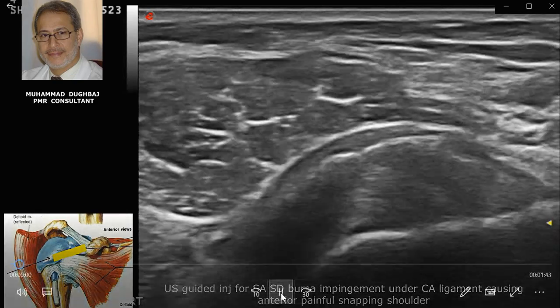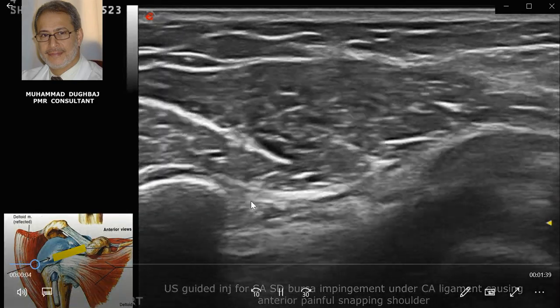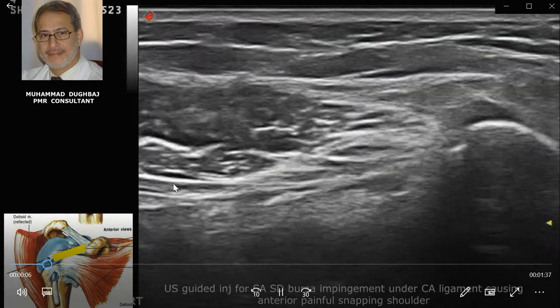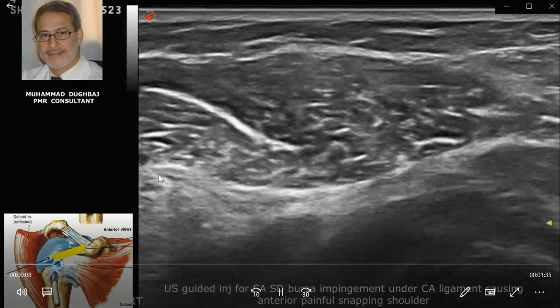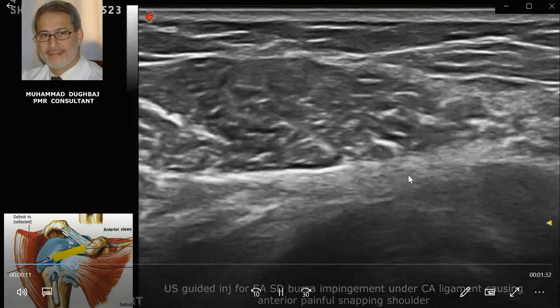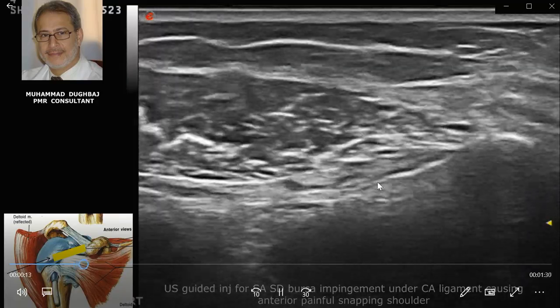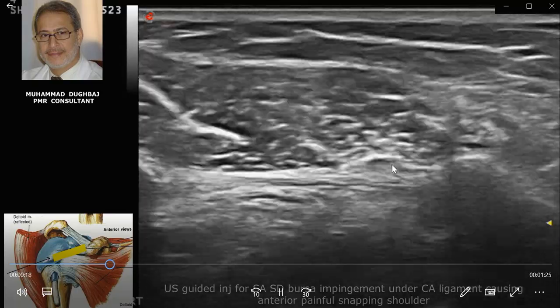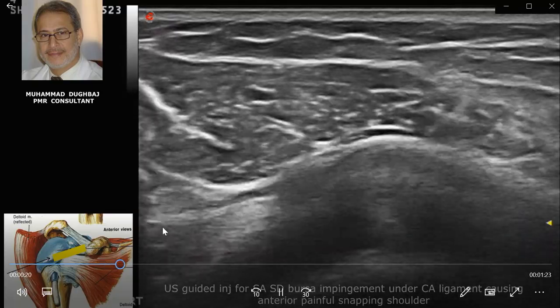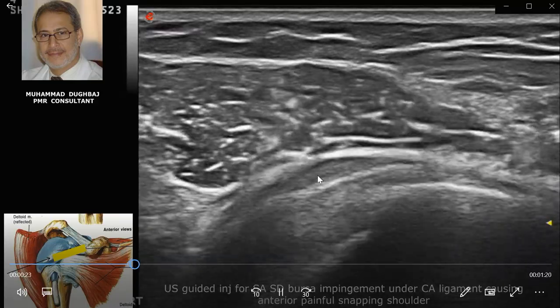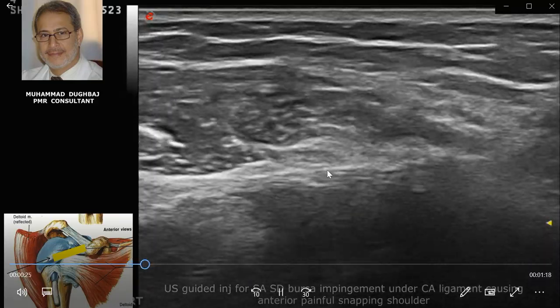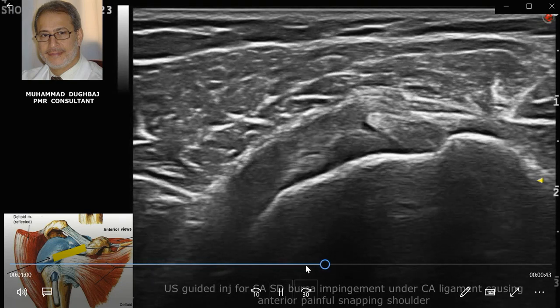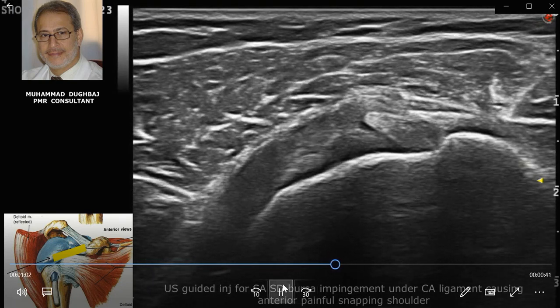During internal rotation, you can observe the coracoid and the coracoacromial ligament extending from the coracoid. The synovial tissue is visible here, causing bulging and pushing the coracoacromial ligament. The impingement occurs not under the coracoid but here — you can see the synovial tissue hypertrophy and the coracoacromial ligament clearly.